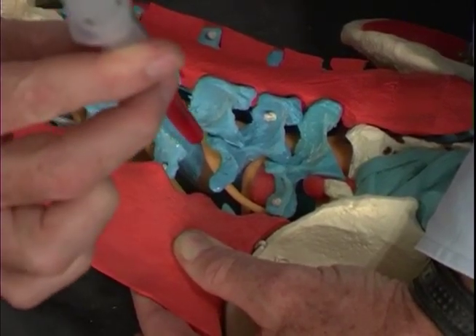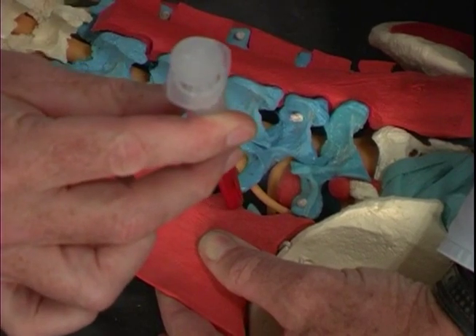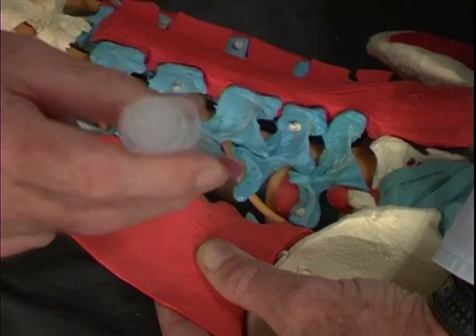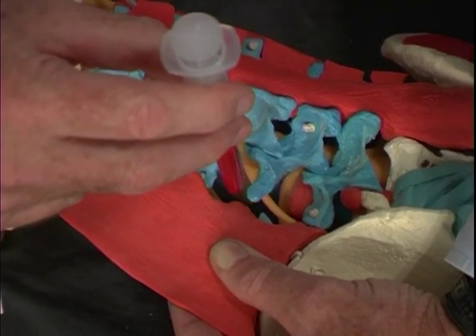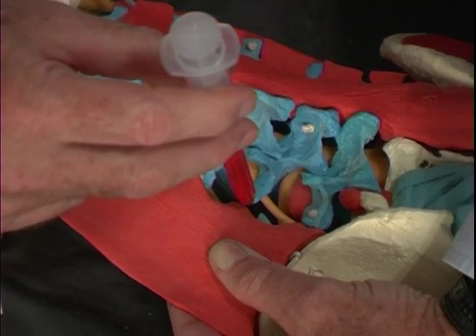Our direction of our needle is slightly medial, and we can actually hit the bone and then walk off it and come back to the tip of the bone as close as we can. If we don't hit it here, we find there's a lot of space here, and so we may wish to redirect and go down a little bit or up a little bit to hit that tip of the transverse process.